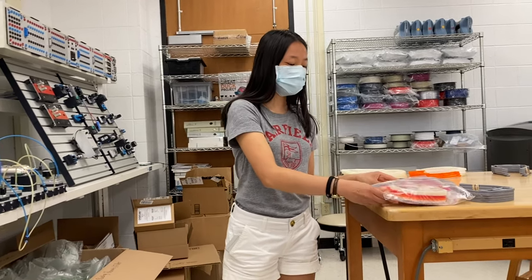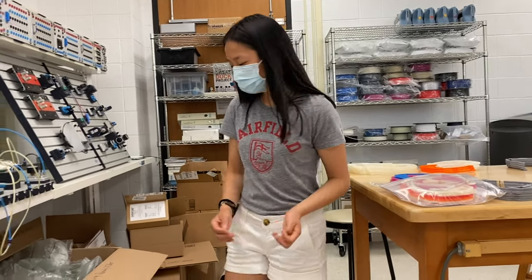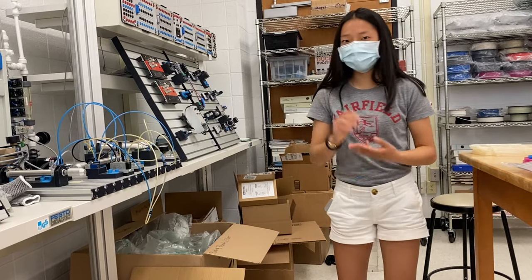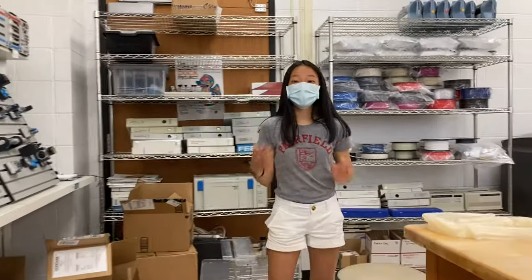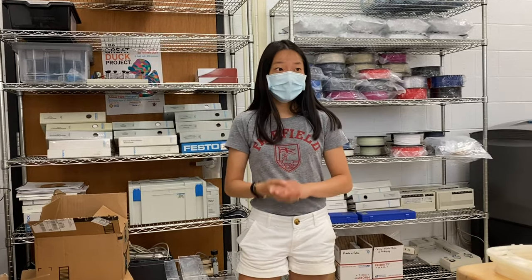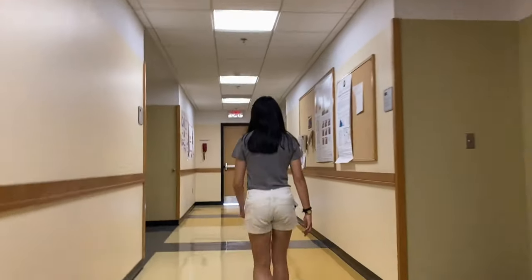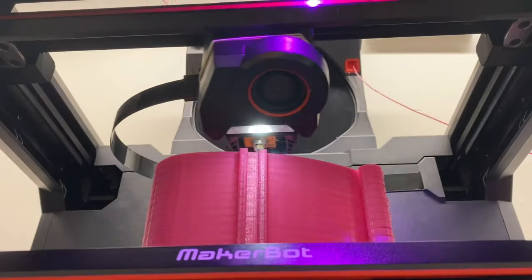We'll organize each of these plastic bag packages for pickup, delivery, or mail. Now what we want to show you is our second lab, which is on the other side of Bano. In this room, we have three more MakerBots for printing.